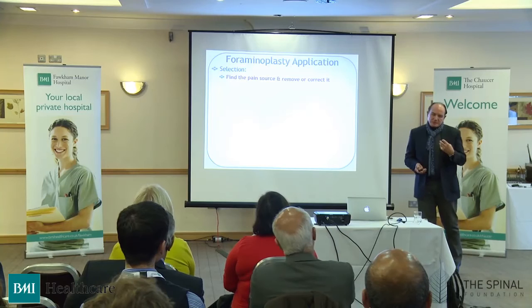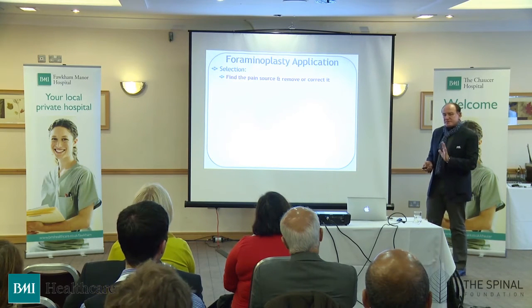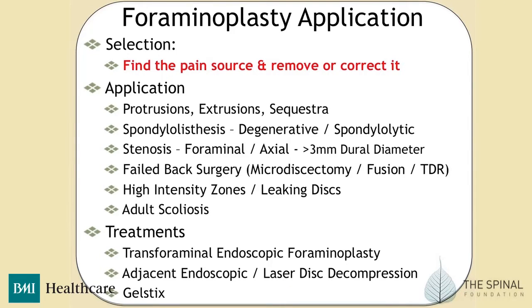When you're thinking, well, what's this really going to do to my practice? Well, for us, the philosophy is different. We need to find the source of the pain and then just remove the causal agents as minimally as possible. And we can apply that to protrusions and extrusions and sequestra, because we can go into the epidural space, find the sequestra, and take it out through the side door.